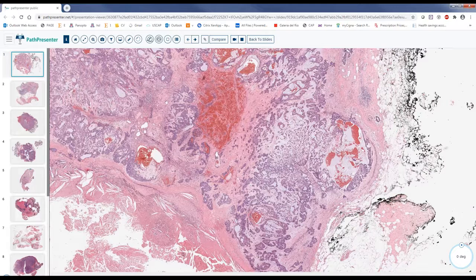So we will do some stains, and we'll go with the case of carcinoma ex pleomorphic adenoma, on how to measure the invasion. Okay, so we'll check into that later on. So the stains, as somebody discussed, are EMA, GFAP, S100. We can do P63, cytokeratin positive. It's not that helpful, actually. It's not something that will give you the magic answer.